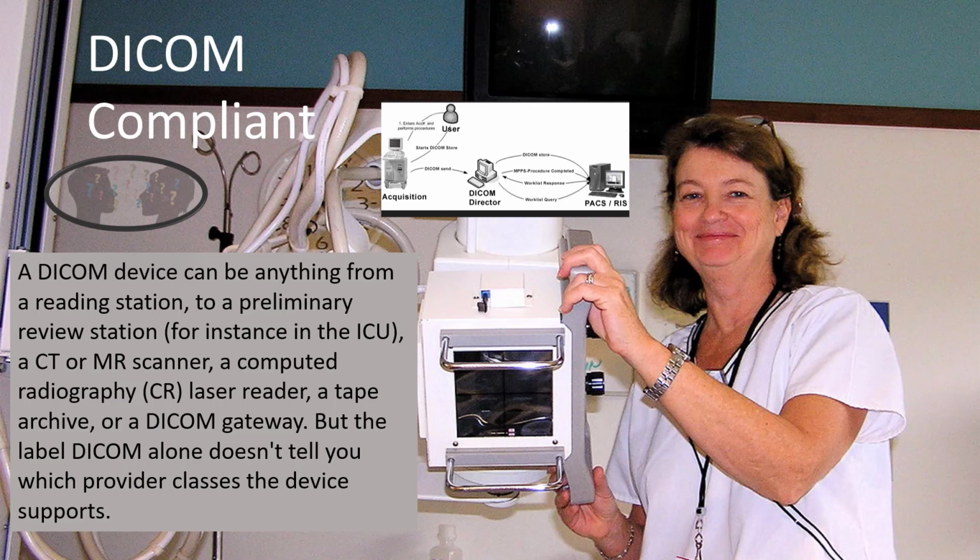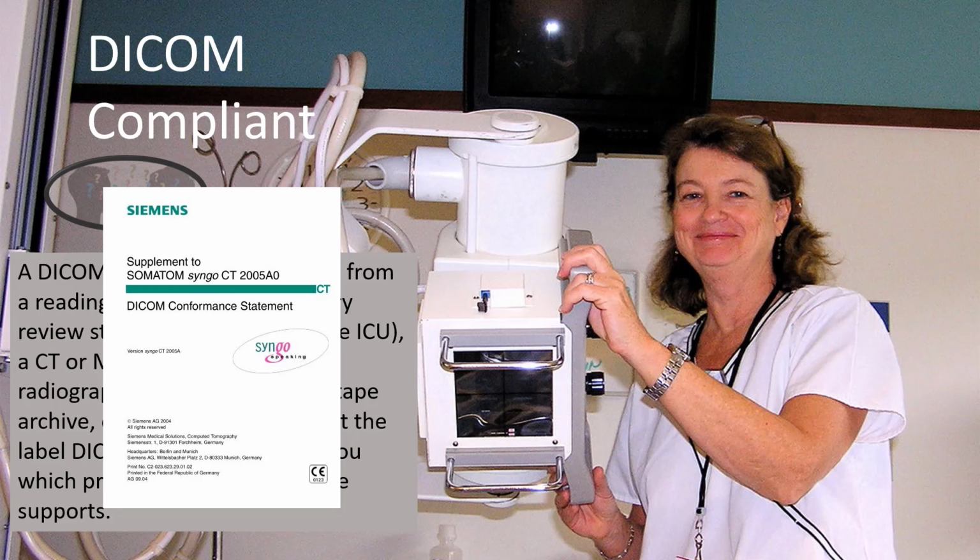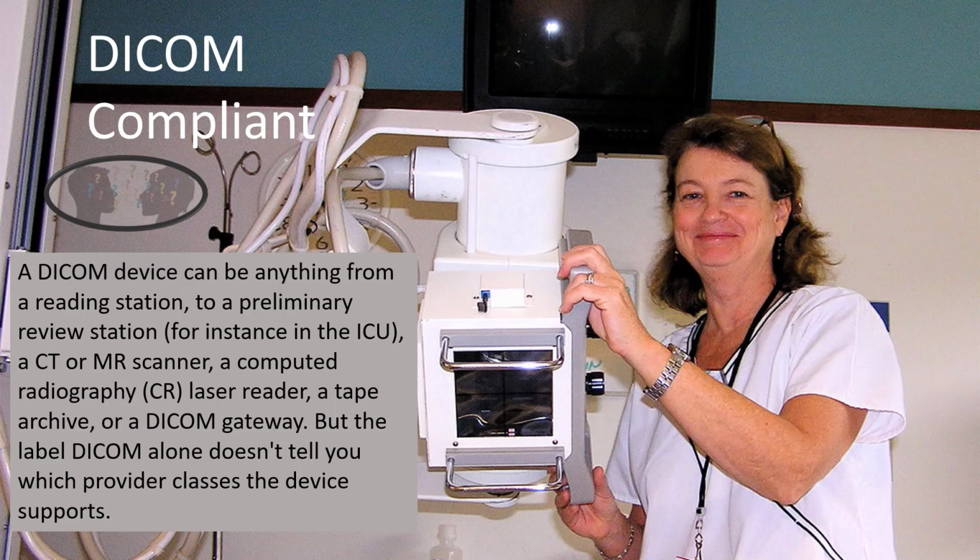So how do we know which portions of the imaging system are compliant with DICOM? Manufacturers must provide to users or customers a DICOM compliant conformance statement to illuminate just that question. How does the equipment work, and which pieces of equipment can it interface to?